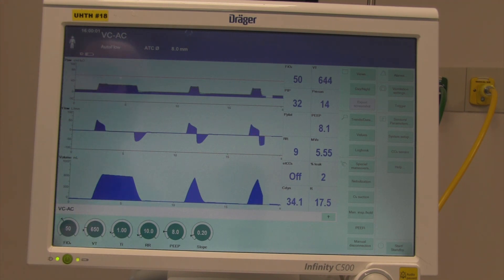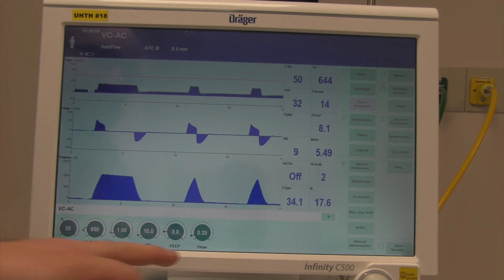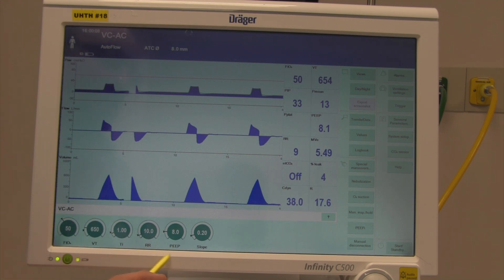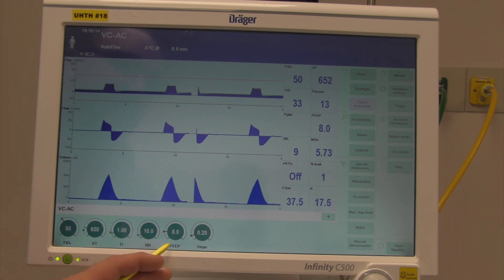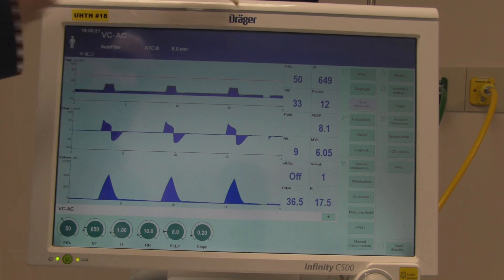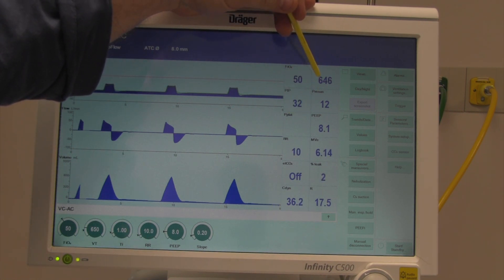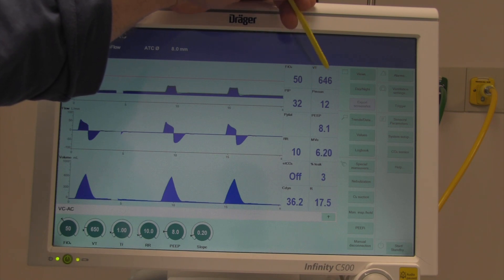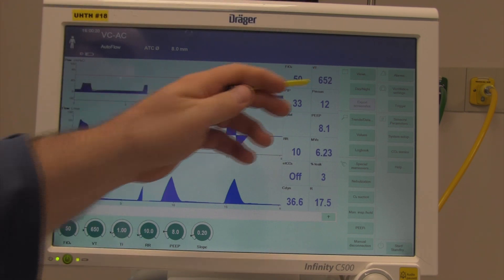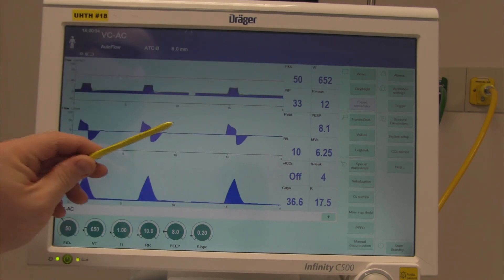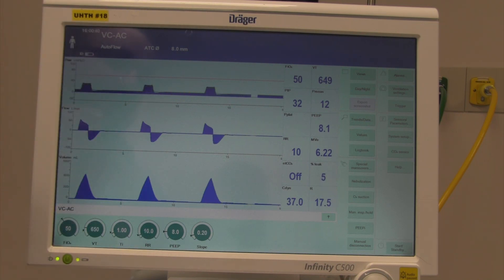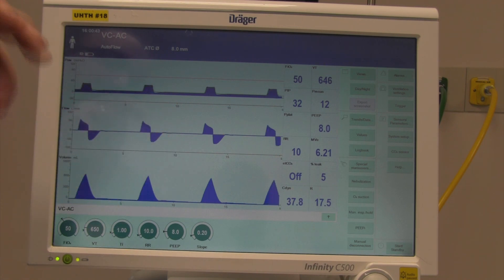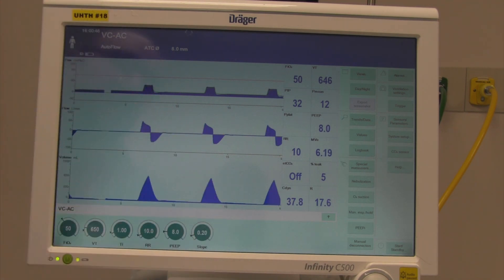Figuring static compliance takes the plateau pressure and removes the PEEP level, because PEEP can really change your plateau pressure. When we factor out the PEEP level — which I have set at 8 — we can get a statistic showing exactly how much pressure it takes to hold that tidal volume. You can be delivering the same tidal volume for days, but if your plateau pressure slowly goes up, the lungs are becoming more stiff.